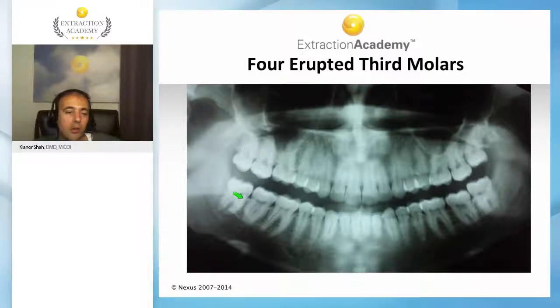These, on the other hand, you can use the mesial, you can use the buccal to trough and do the same in extracting the teeth. And then we'll discuss this big issue here with the nerves and arteries and veins based on our anatomy lecture, and the things to look out for and making the right decisions as you do wisdom teeth.